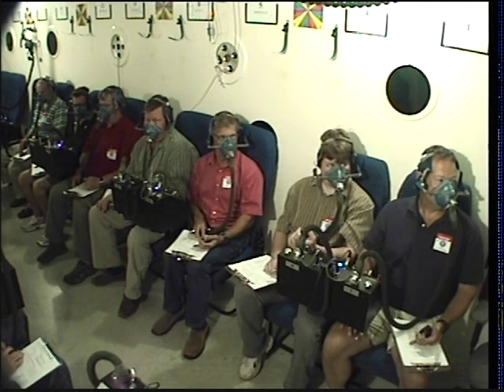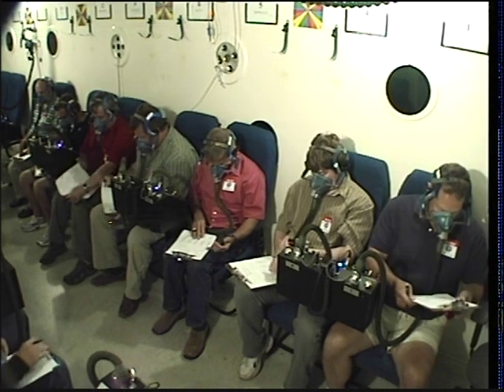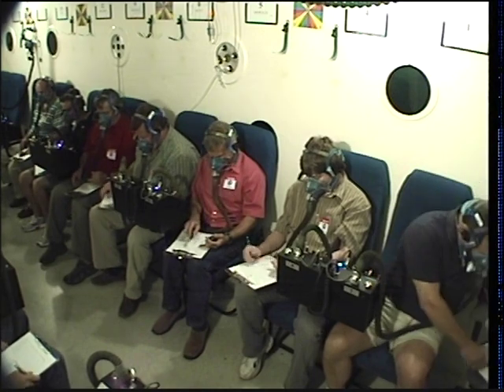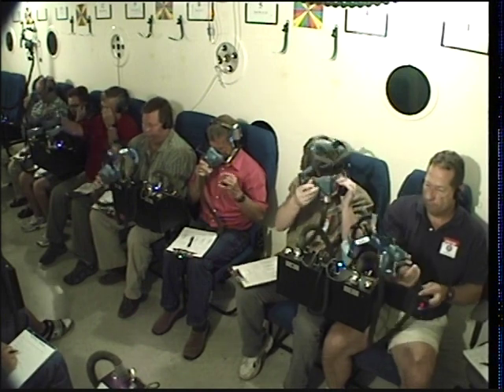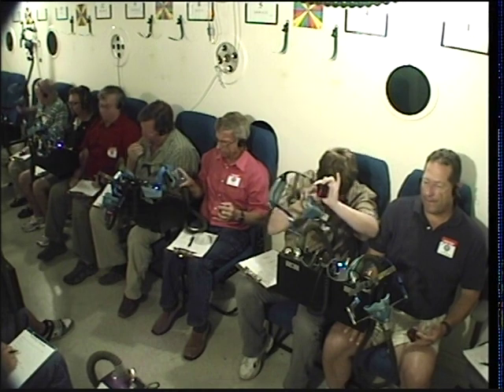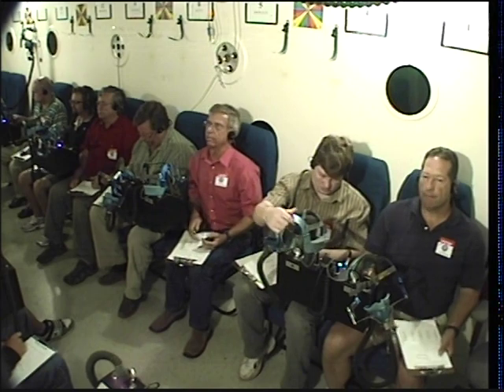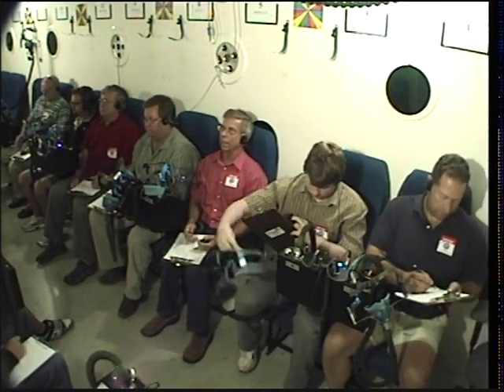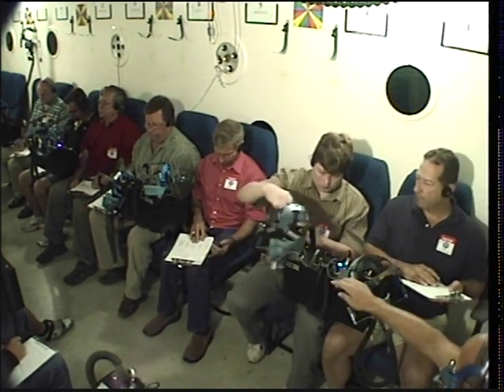All right, everybody turn your worksheets over. We're going to reverse roles. And on my count back from 3, everybody on Brian's side, you can go ahead and take your mask off. 3, 2, 1, mask off. And again, try to do a standard whistle so you guys can see exactly what they were having trouble with. And then set a baseline for your vision. Either check a person out or a color chart or whatever you want to, but use that same object or person throughout the remainder of the demo. And is it Benjamin? Just set it right on the hose where it comes out of the console there.